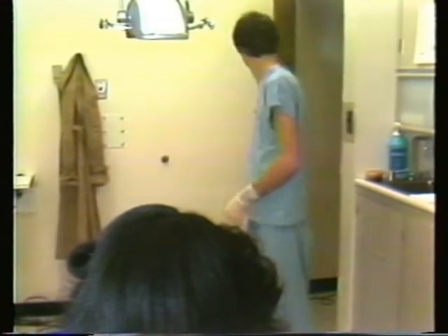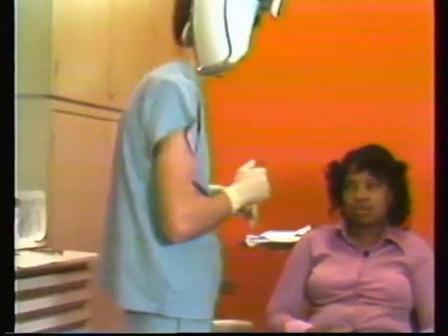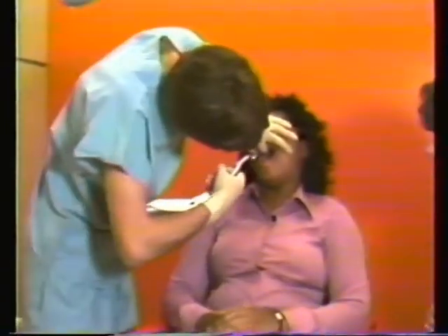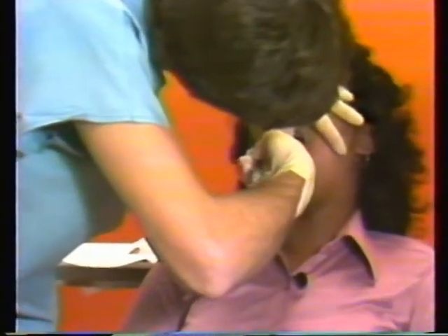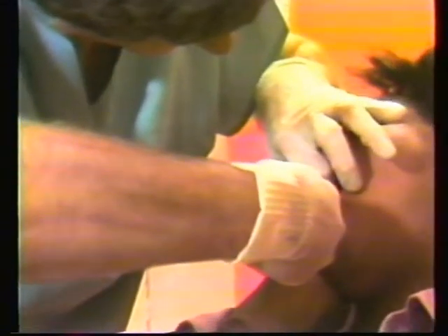Okay, I'm back. Okay, let's get that tooth out now. Open real big.